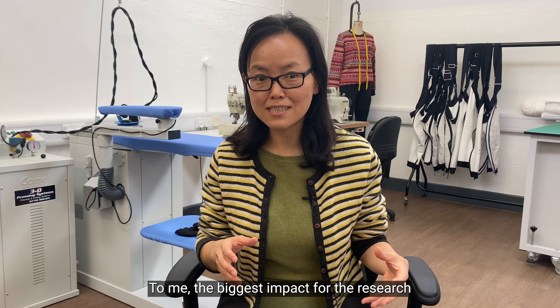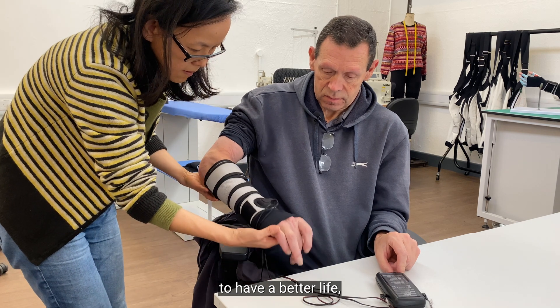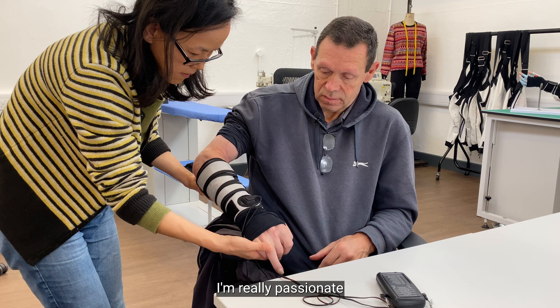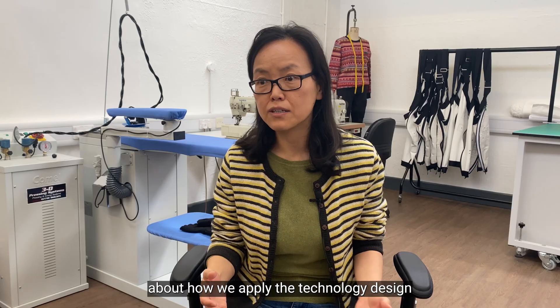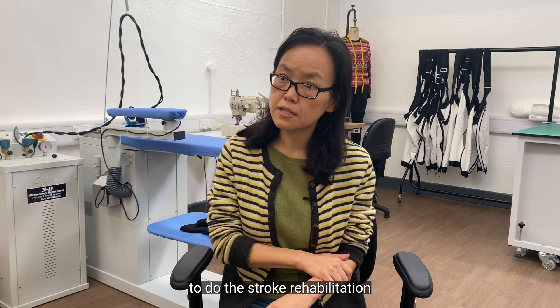To me, the biggest impact for the research is to enable people to have a better life, especially for those who've got chronic conditions. I'm really fascinated by how we apply technology design to enable people — for example in this case — to do stroke rehabilitation independently at home.